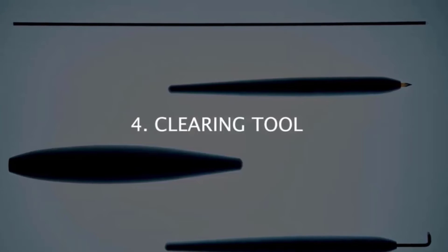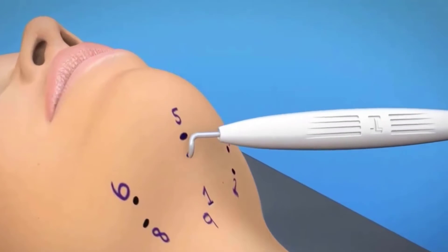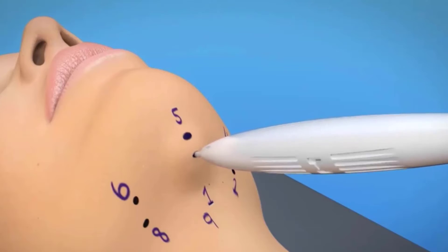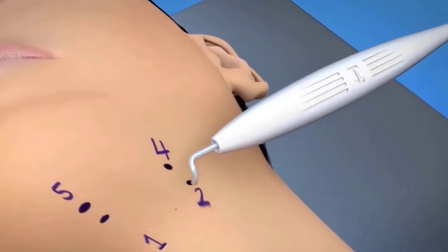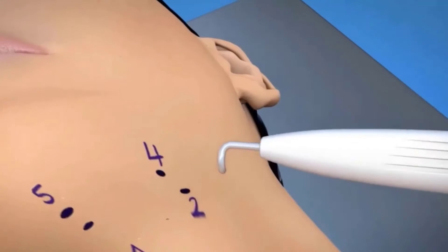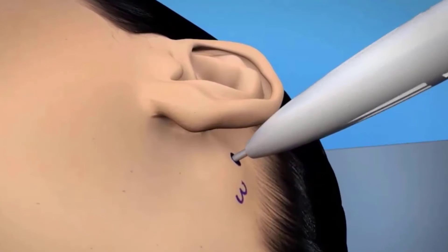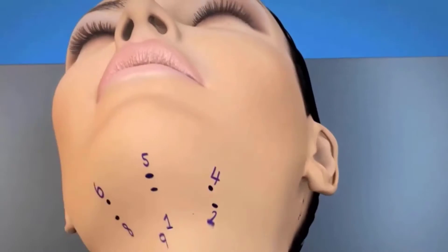The clearing tool is then brought to the field and is used to clear all the dermal attachments around each puncture site. It is designed in a way that allows rotation in a clockwise manner. Each puncture site should be entered into with the clearing device, with rotation of the device approximately 2 to 3 times clockwise. This allows the clearing away of dermal attachments so that the suture rod can be easily inserted, pivoted, and transferred underneath the jawline. Care must be taken to keep the clearing device just in the subcutaneous space, away from underlying nerves, blood vessels, and other vital structures.